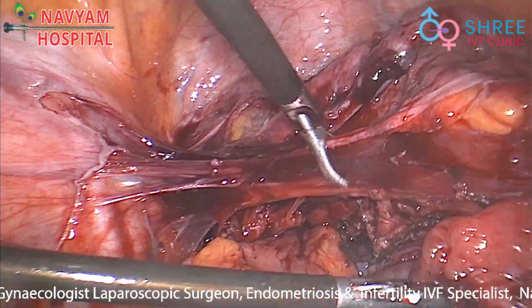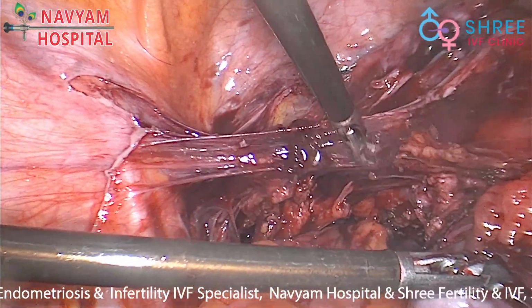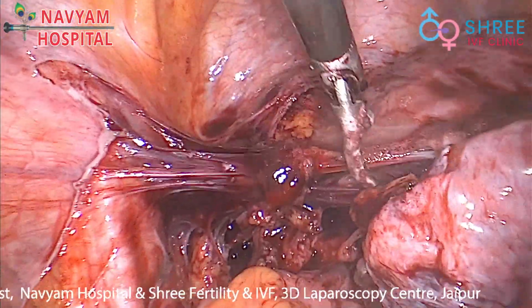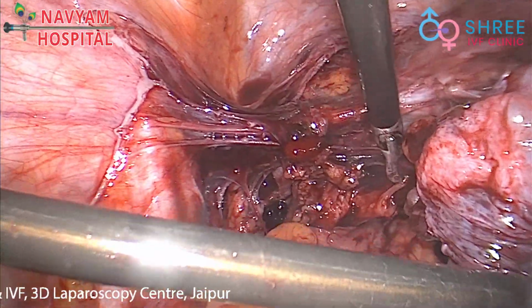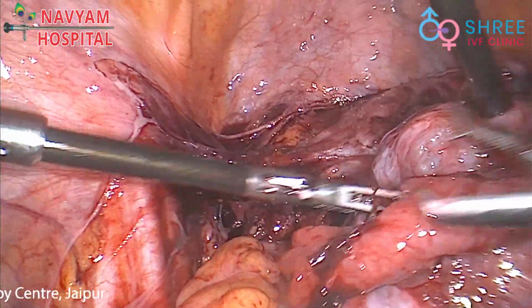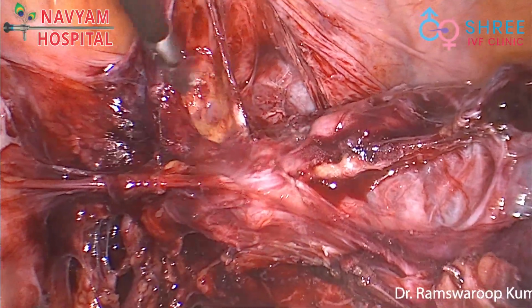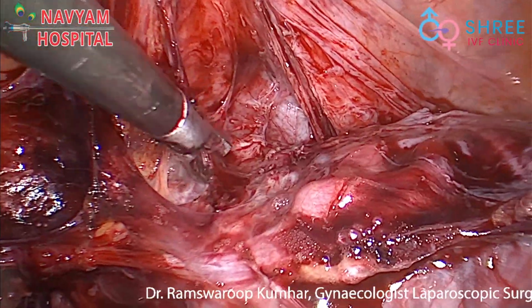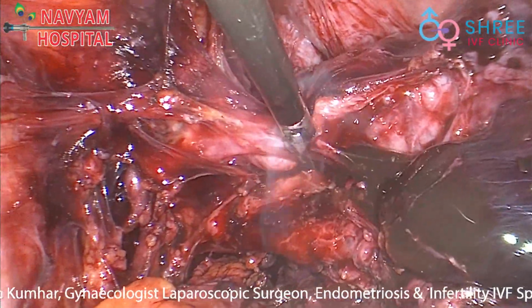The next step is uterine vasculature ligation on the left side. First we have to dissect the fibers of the connective tissue, and then the bladder was held up and slightly dissected deep down on the left side. Then the step is the uterine vasculature ligation.